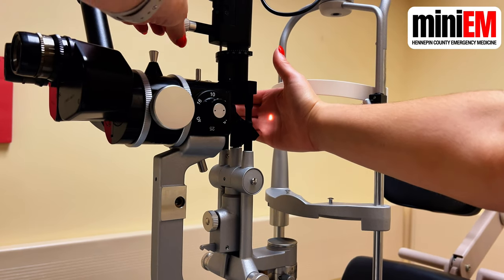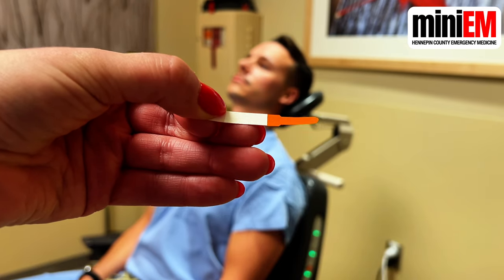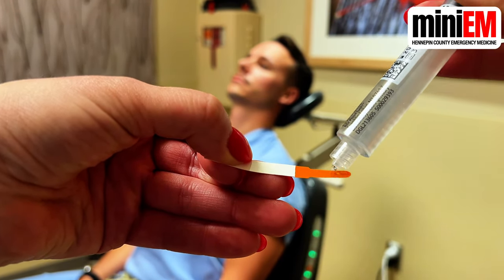Lastly, turn on the blue light by turning the top knob on your light source all the way. Stain their eye with fluorescein dye — check out our separate video on that. Then look for corneal abrasions, ulcers, lacerations, foreign bodies, keratitis, and Seidel sign.